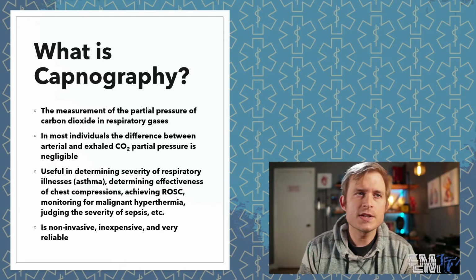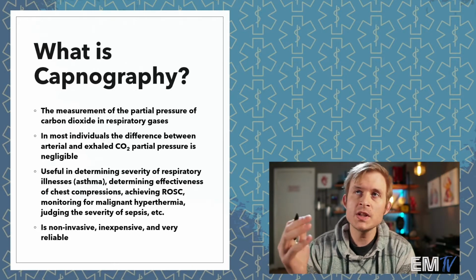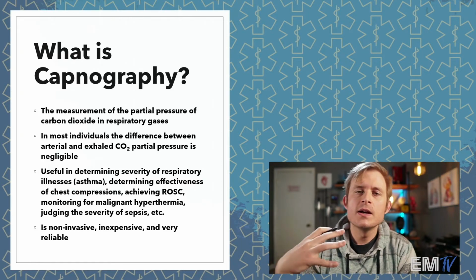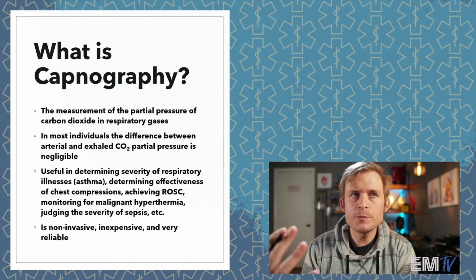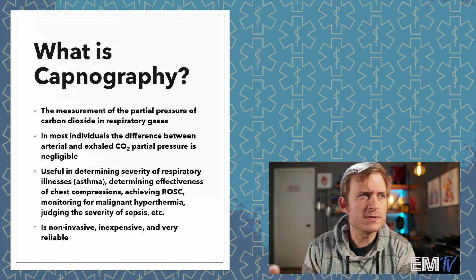The nice thing for us is that this process has been around in theory since the 19th century, but until very recently, when technology became good enough and small enough, it wasn't really used and it wasn't very useful. But because the technology has become very portable and very cheap, you should be using this for pretty much all your patients, especially your critically ill ones. It's non-invasive, it's very inexpensive now, and it's very, very reliable.